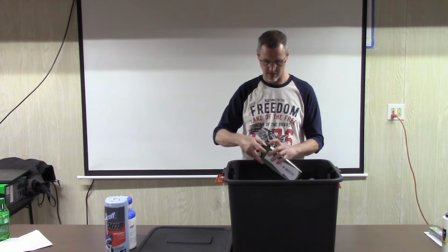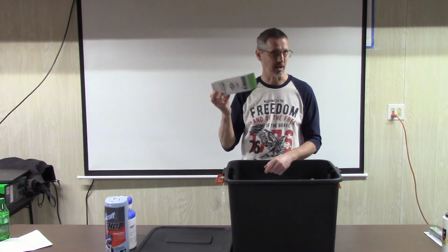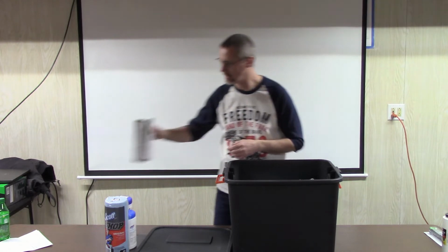Mentioned eye washes earlier. This is just a little eye wash bottle. It's got the cup that you can stick on your eye, and the excess flushes out of there. So we're going to pick up a few more of these, and like I said, I'll have one of these in the garage. Not empty, like it comes. We'll have to fill it with some eye saline. Get one in the basement with the washing machine, and we'll have one in the clinic area.